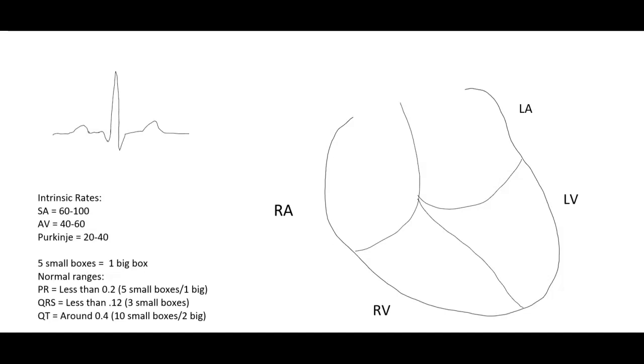This has been a highly requested video by my students, so I thought I would make one up and put it on here. It is a very simplistic overview of a normal heart rhythm. This is specifically for those early level nursing students. Yes, it does get more complex than this, but this is a great starting point.